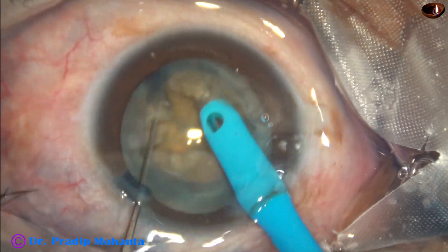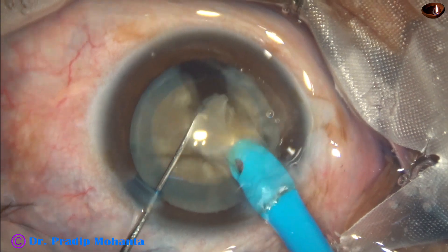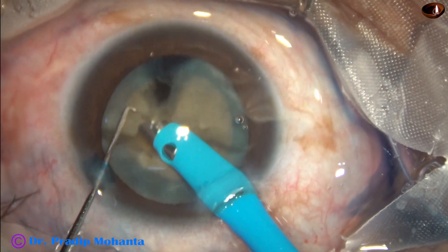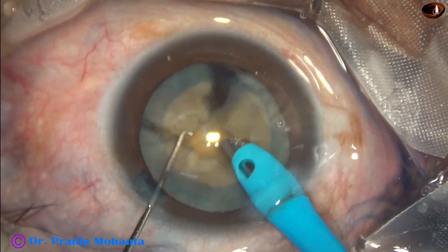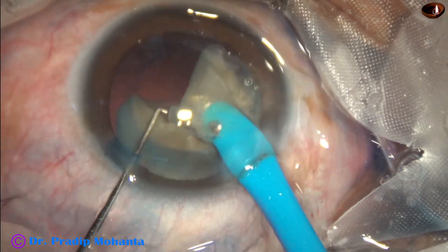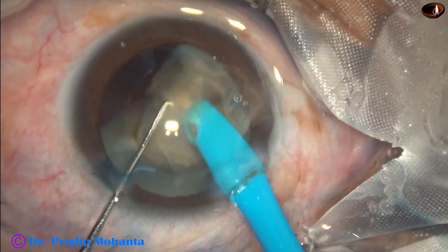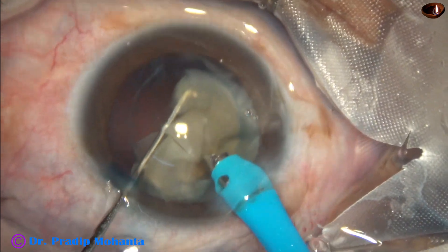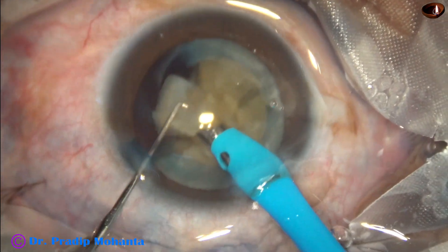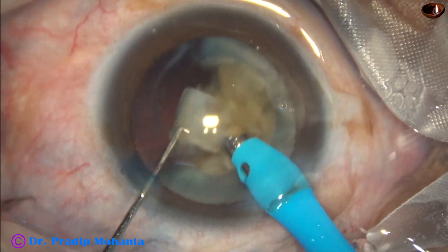Now we can attempt separating these pieces. The pieces are not separate, but what I am doing is eating off the peripheral part of the pieces. A central stump remains joined. The peripheral part is shaved off.